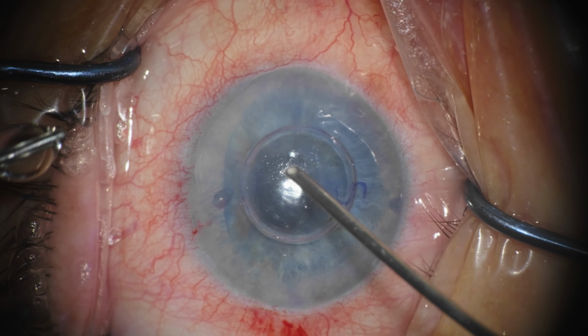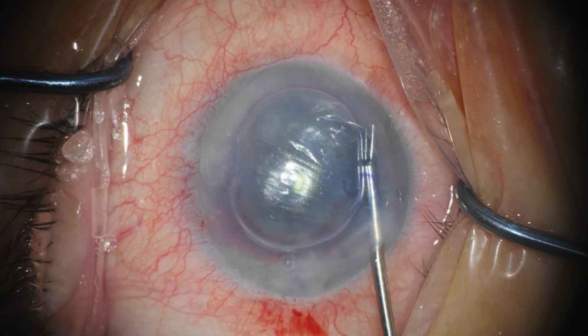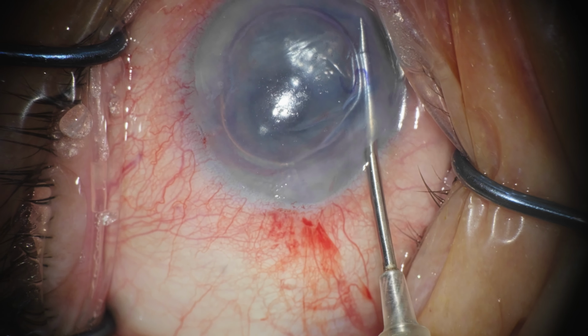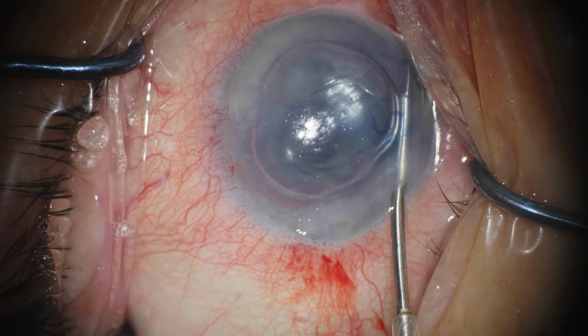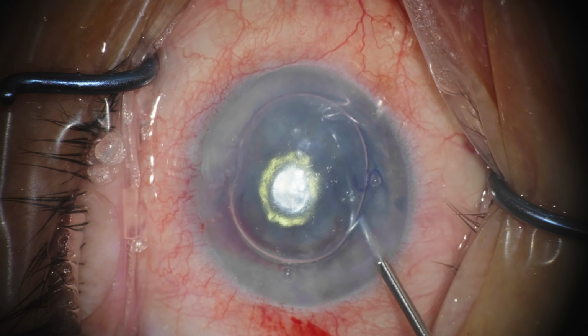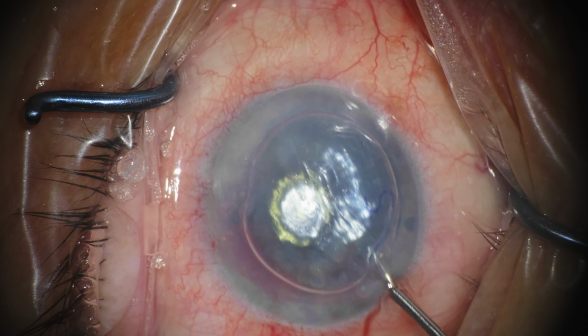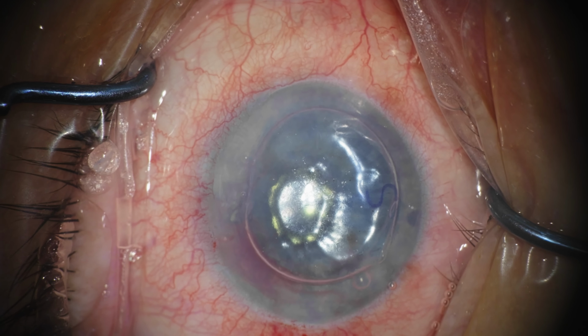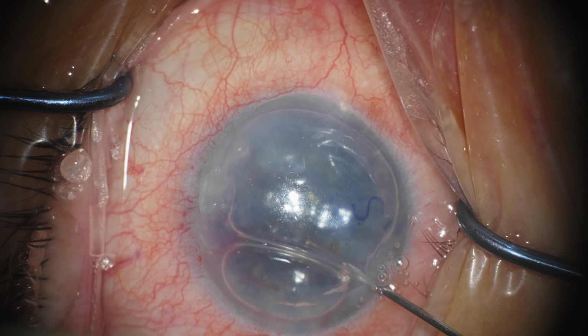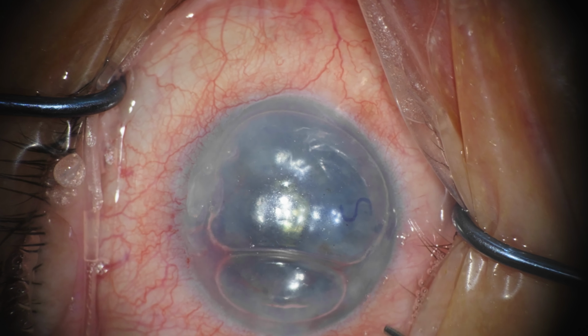And by accident, we create another PI that then starts to bleed in the process of doing the vitrectomy. But at the same time, there was a posterior step that we managed to see on OCT, which was actually preventing the graft from unfolding. So then we pulled the graft to 6 o'clock to avoid that step and complete the fill.